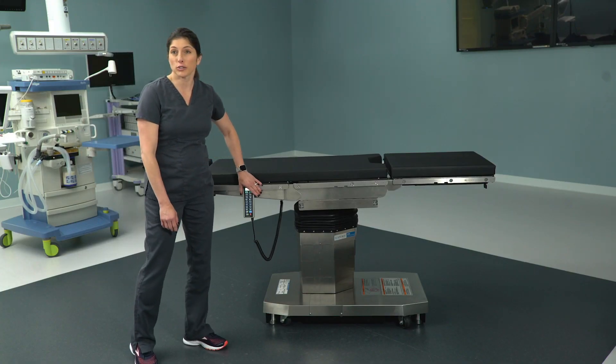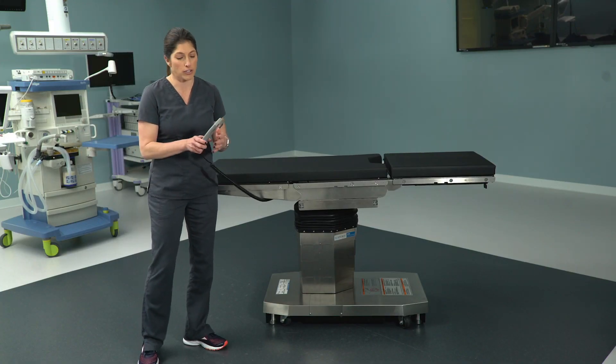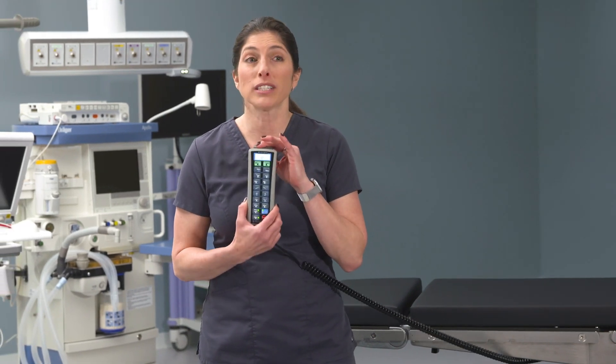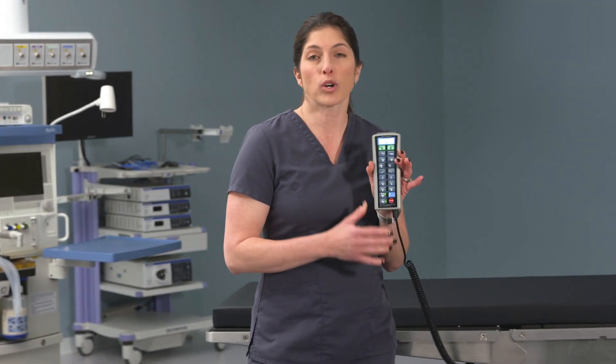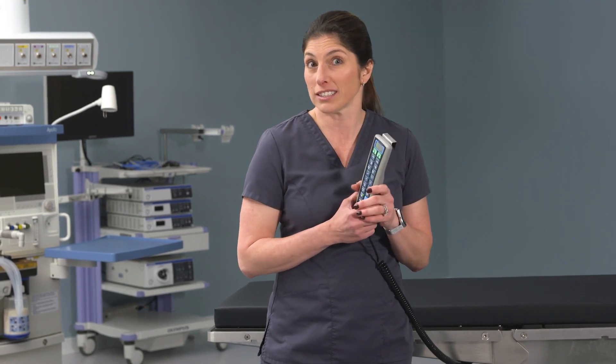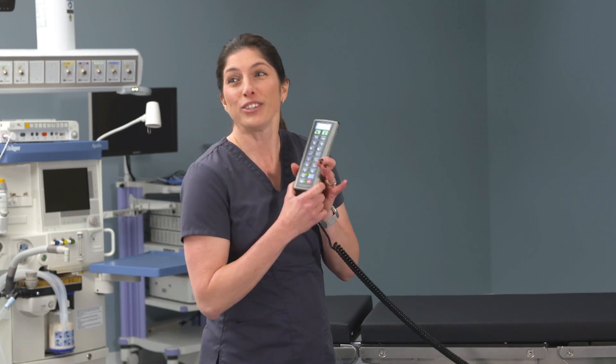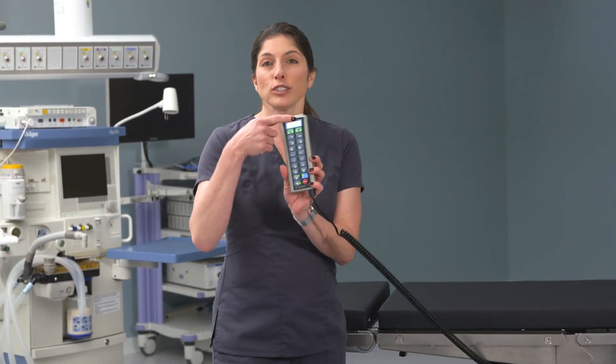I know that anesthesia will primarily be using this, but it's important for you to know how it works and its functionality, so that in the instance that anesthesia maybe doesn't know what they're doing — which never really happens — you'll be able to help. The first thing you'll notice, contrary to the 3085, is that there's an LCD screen at the top of the hand control giving you lots of information about the table.